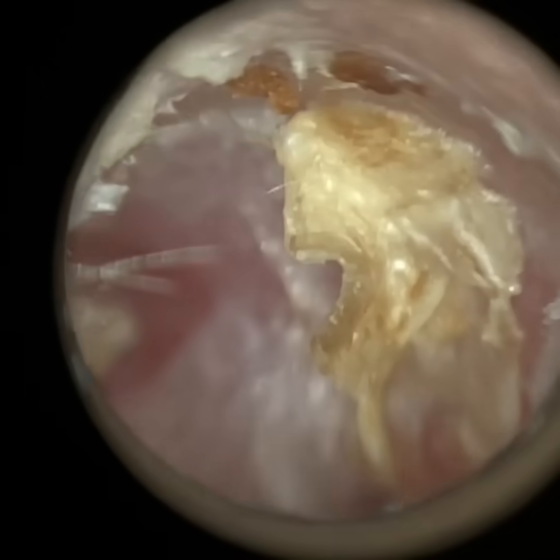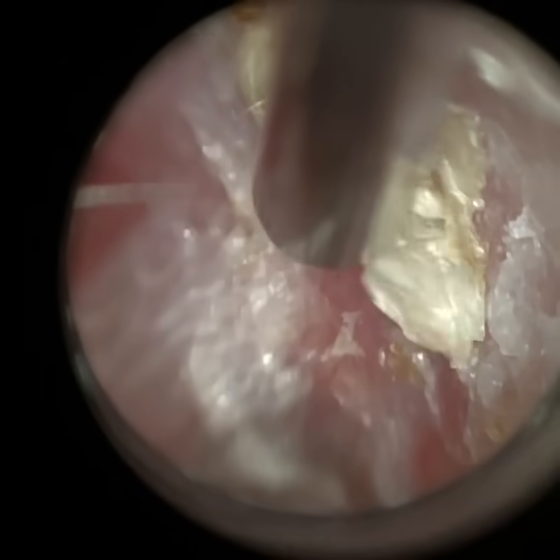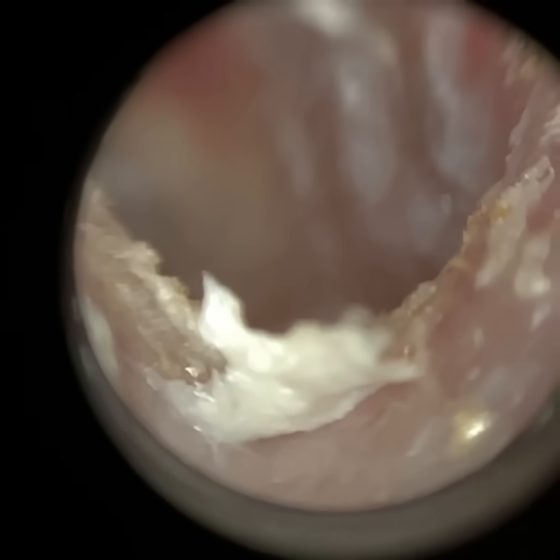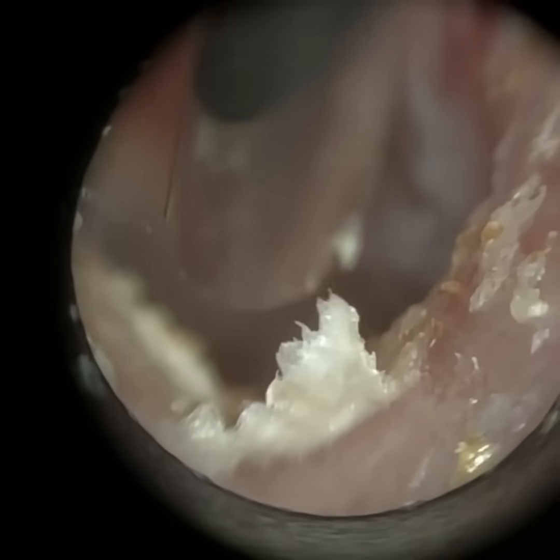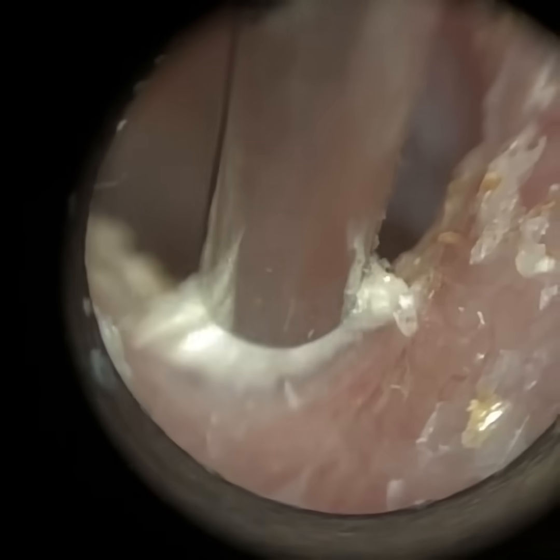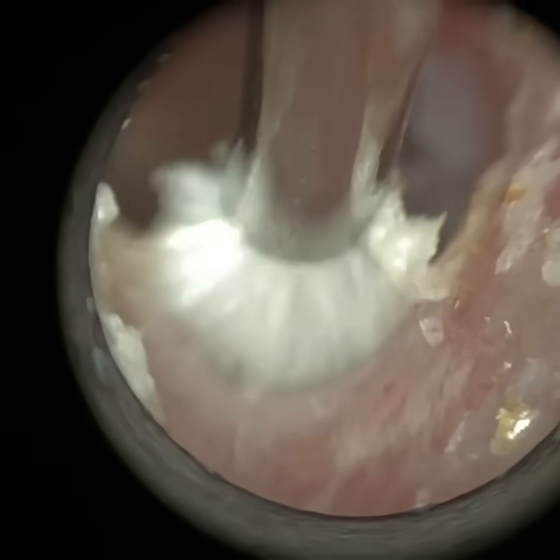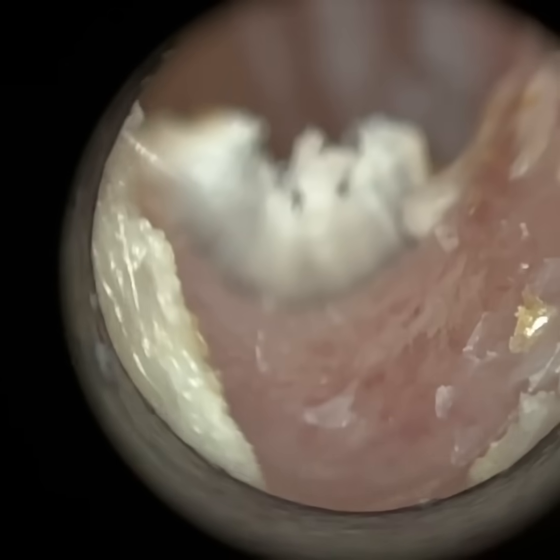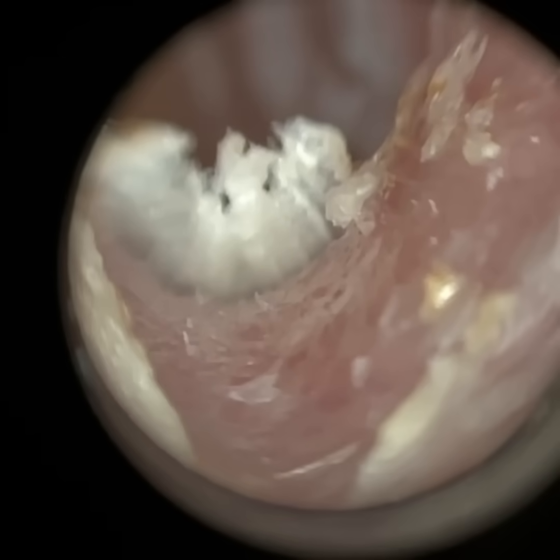What water can do is wash away the natural oils and sweat produced by the ear — sebum and an oily sweat — which are designed to lubricate and moisturize the surface of the skin. It also prevents the internal skin from losing its moisture, acting as a hydrophobic layer, and helps repel external water. Excessive water can leach those oils away, exposing the underlying skin, which then becomes dry and cracked. The skin can also absorb the water, overhydrate, swell and crack — resulting in macerated, broken skin, as we see here.